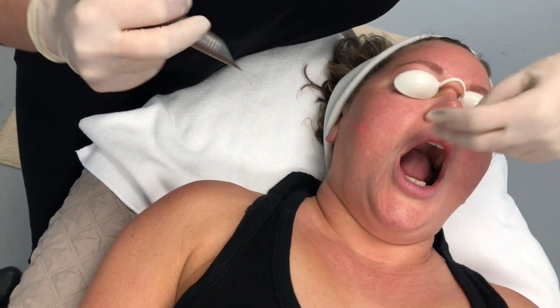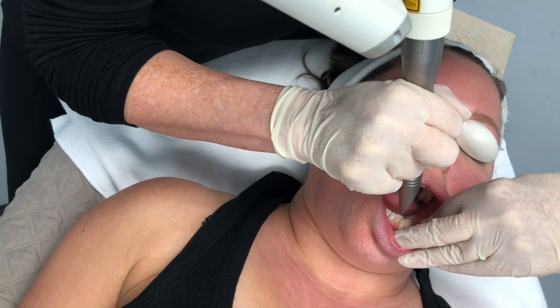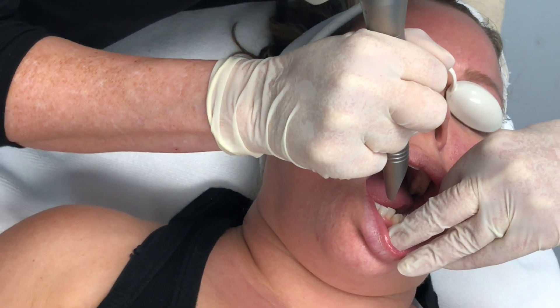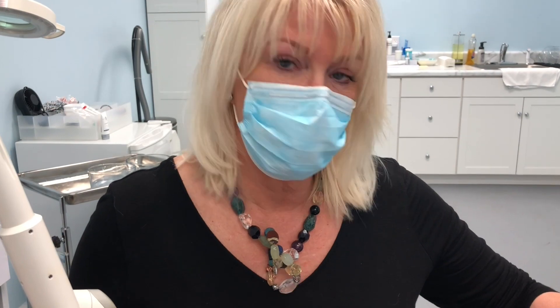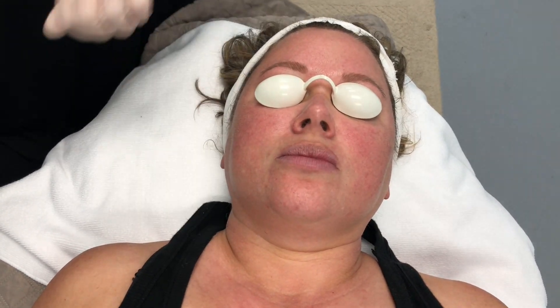Then the marionette area. After that, I let them switch the tongue around to re-wet, because as long as that oral mucosa stays moistened, it's not going to hurt — it's just going to feel warm. If it starts feeling stingy, they're probably just getting dry and you need to stop and let them move their tongue again. You're going to do that three times on each side — three passes on one side, then three passes on the other.